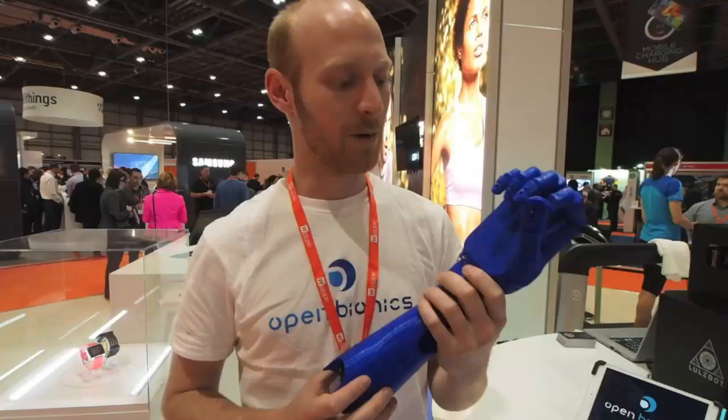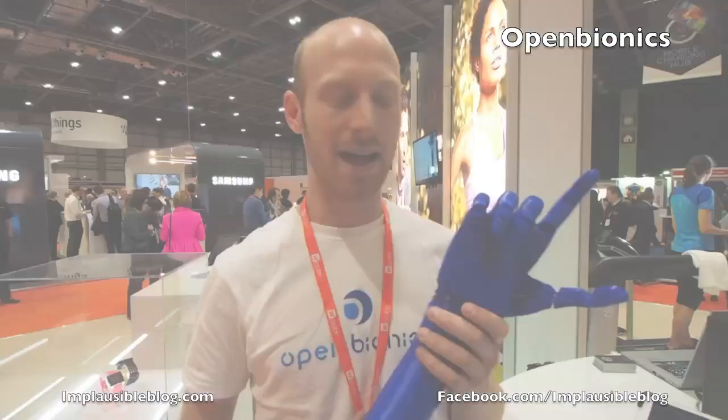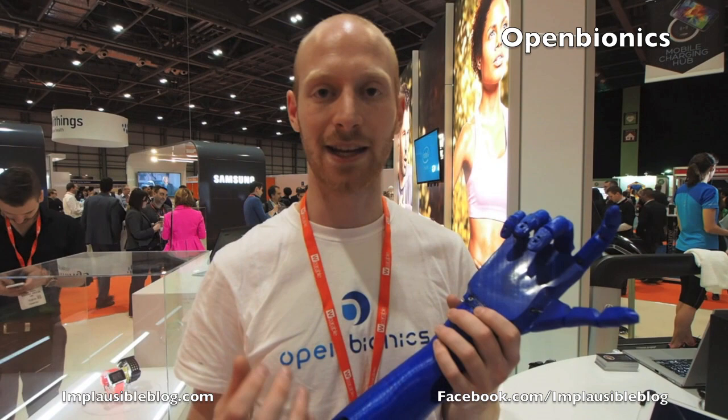We're developing incredibly low-cost but advanced robotic prosthetic hands. This is one of our prototypes — it's 3D printed and we print it in one single piece. The hand can move each finger individually, so it's got a wide range of different movements. Right now the control mechanism is a bit basic, so the amputee can only tell it to open or close. It will then adaptively grip objects of different shapes and sizes.